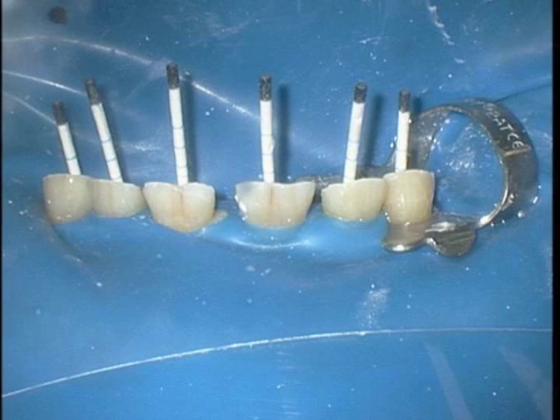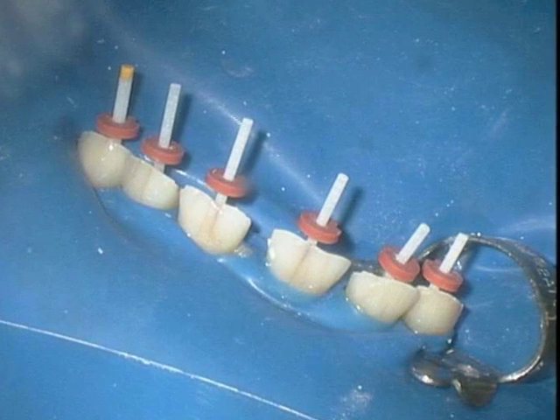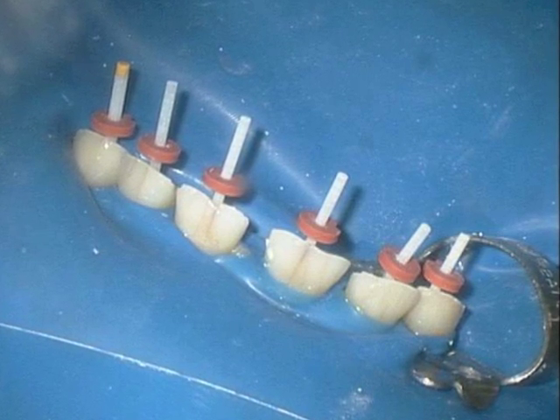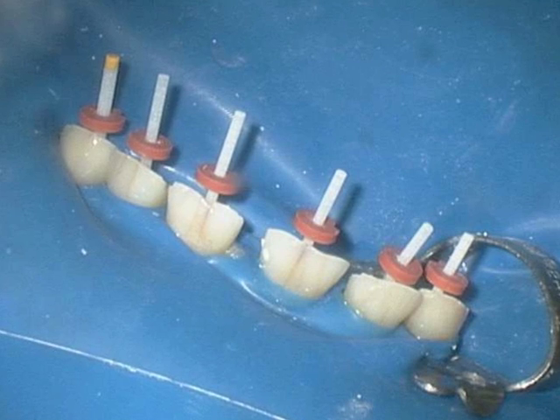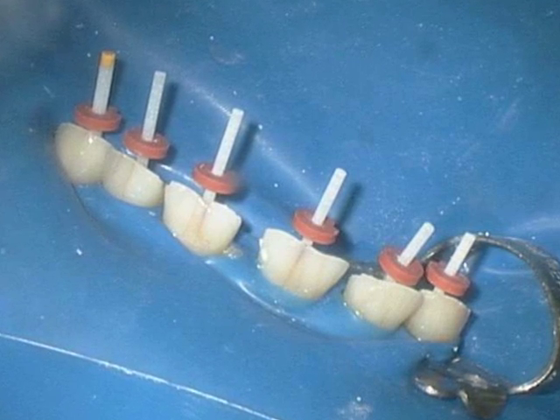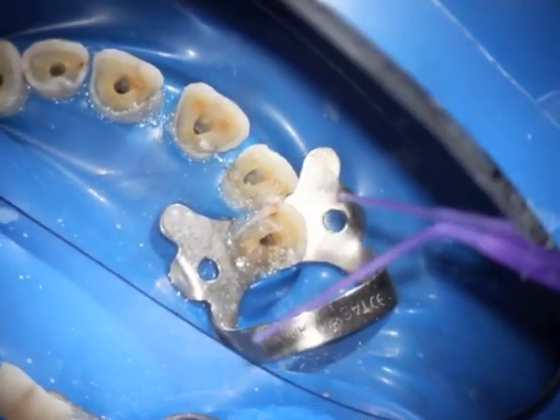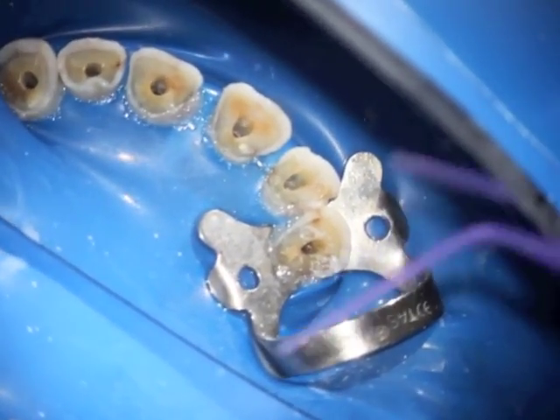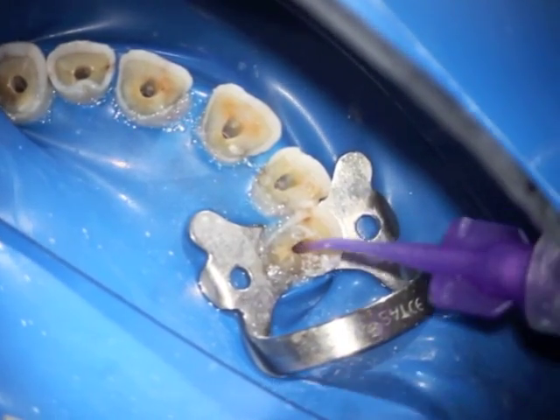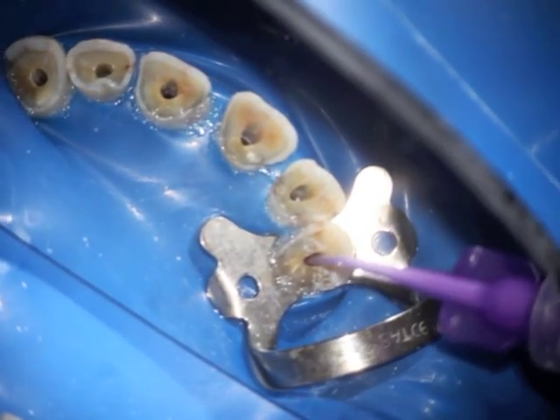After the fitting of all teeth, the corresponding size fiber post EndoSequence posts have been fitted and stoppers have been used to demonstrate the reference point for these teeth. Here you can see the rubber dam isolation using also Opal Dam to seal those areas.